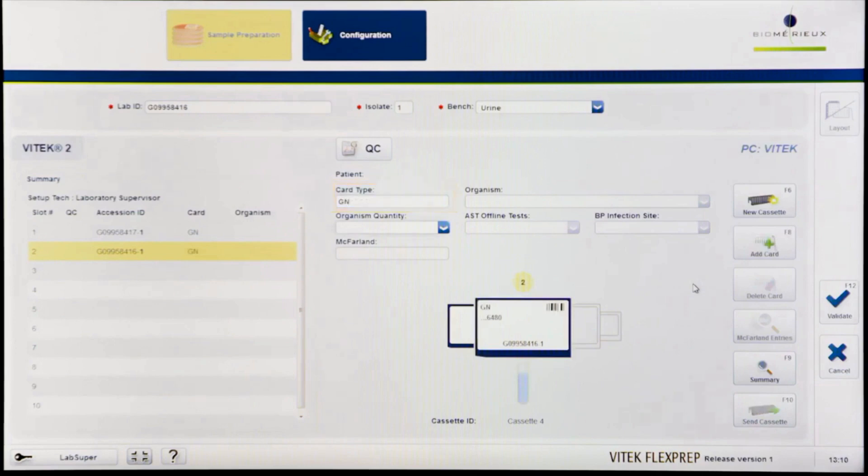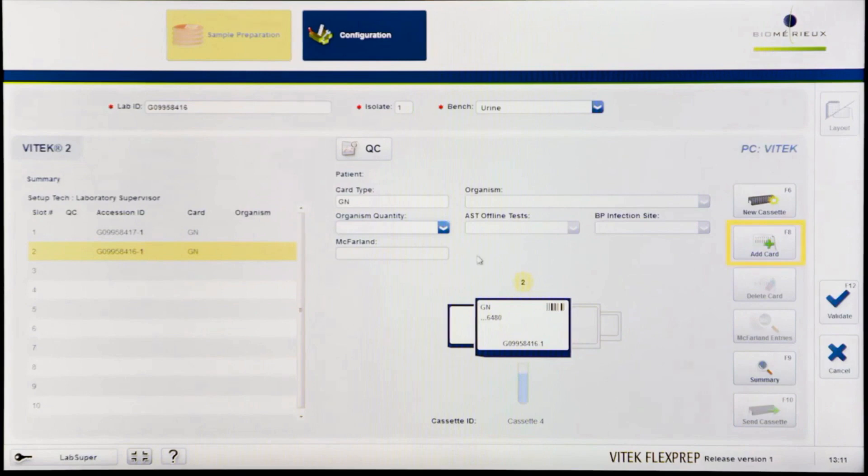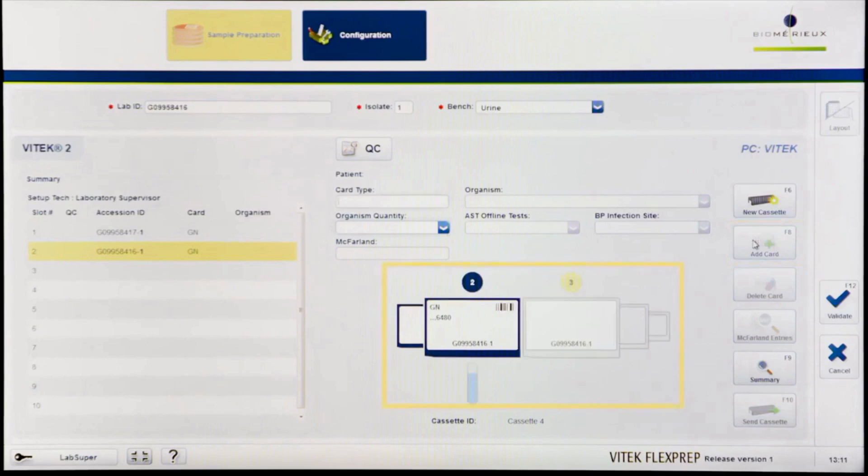Once the card type is entered, a graphic of the isolate will appear displaying a card and a test tube. To add an AST card to the ID card, click the Add Card icon or press F8. This will add a second card graphic next to the ID card.